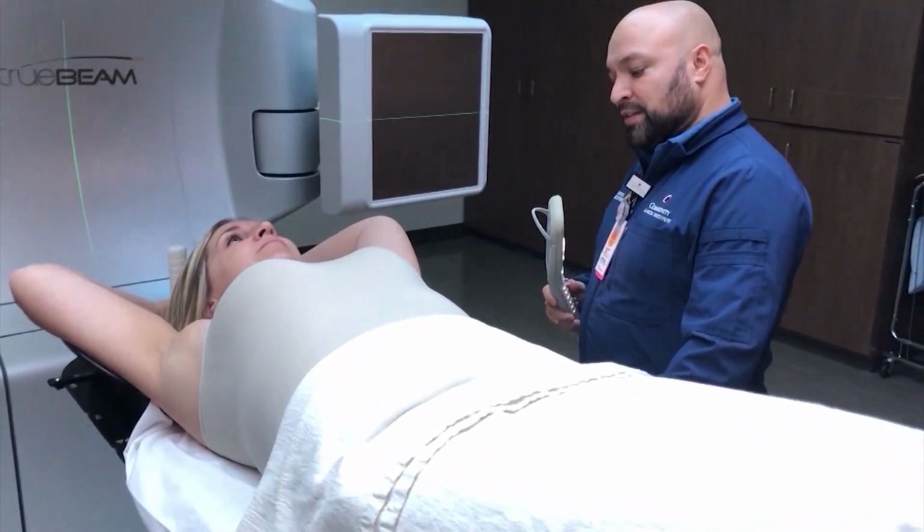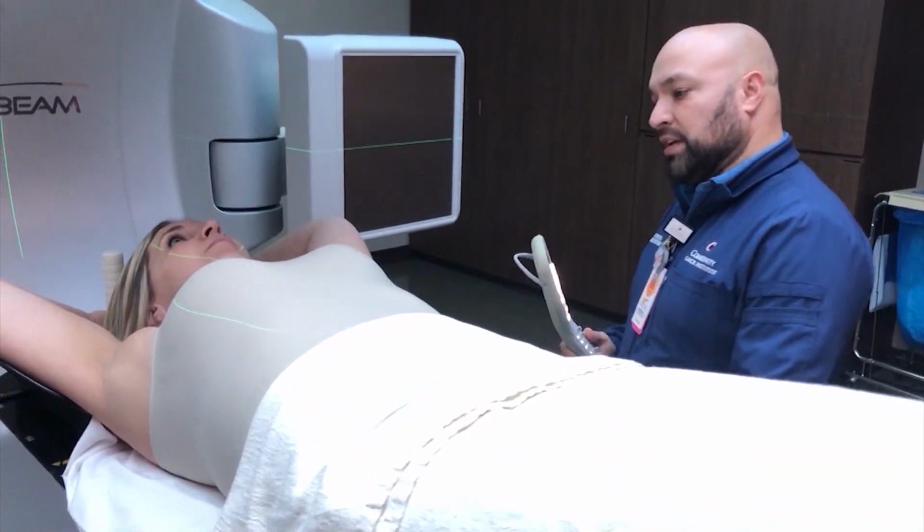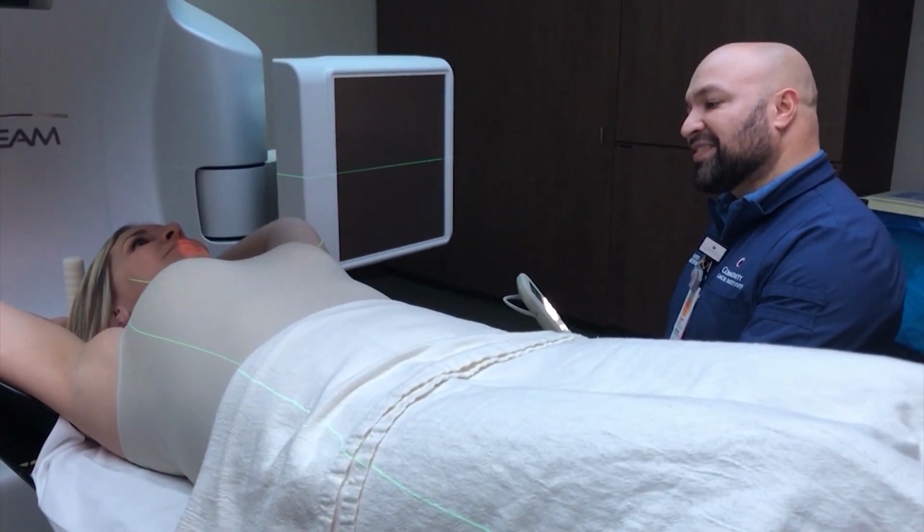Radiation therapy for left-sided breast cancer can contribute to cardiac disease. So although it has a tremendous impact on survival and local control for breast cancer, we also have this potential complication down the road. Minimizing the radiation dose to the heart really saves patients a lot of trouble. The possible cardiac risks of radiation therapy are significantly reduced with SGRT treatment.